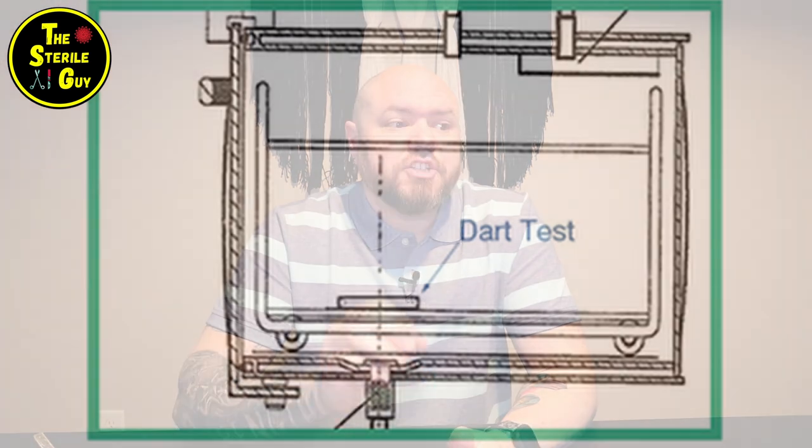Lastly, I want to show you where the air removal test goes inside the sterilizer. It should go in the bottom closest to the drain, and this is for several reasons. One, that is the coldest part of the sterilizer. Two, steam actually has less density and rises above air, so if steam collects in the top of the chamber it's pushing air down. So if there's going to be any air in the sterilizer, it's going to be at the bottom — and that, my friends, is an air removal test, which you must perform at least daily.